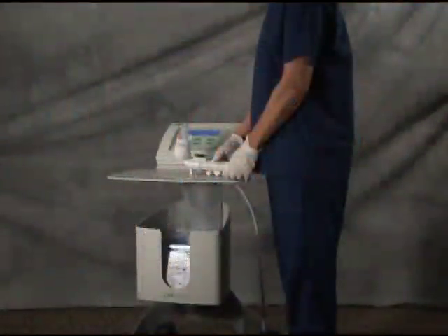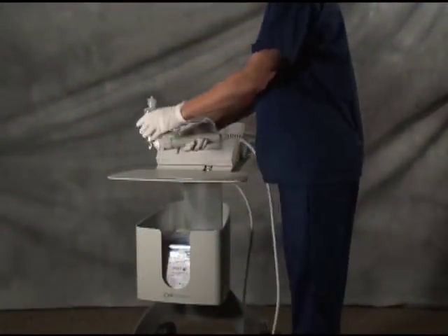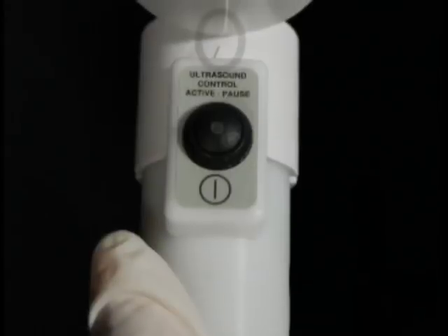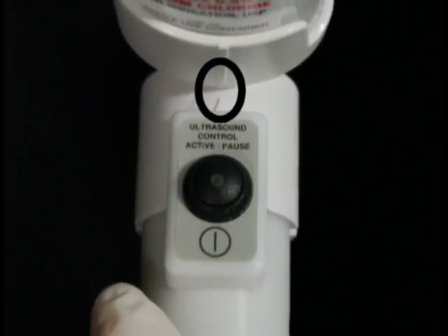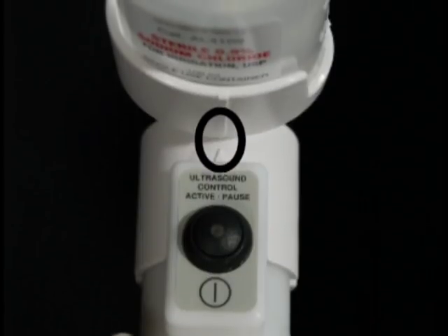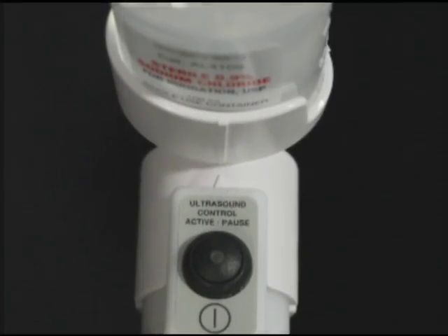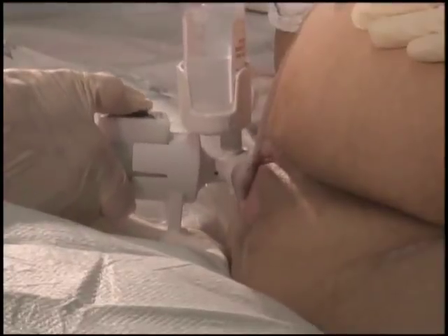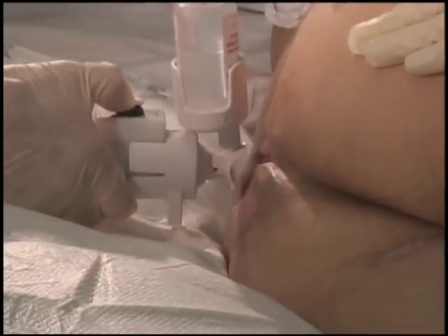To initiate saline flow, turn the saline bottle and applicator cup in a counter-clockwise motion until the on indicator on the applicator is aligned with the on-off arrow on the applicator. Allow the saline to flow through the applicator. This will be noted by saline dripping off the applicator face. This should be completed just prior to starting the ultrasound energy to prevent saline buildup within the applicator.